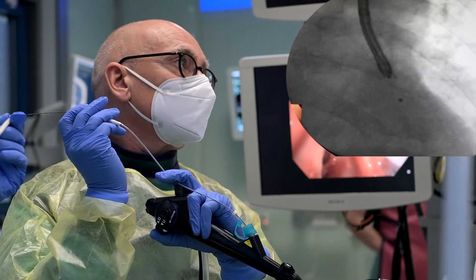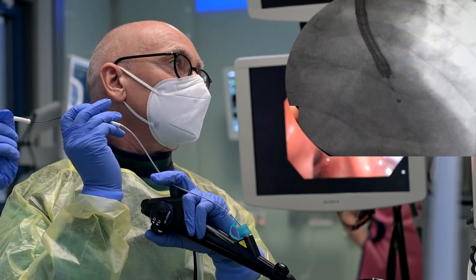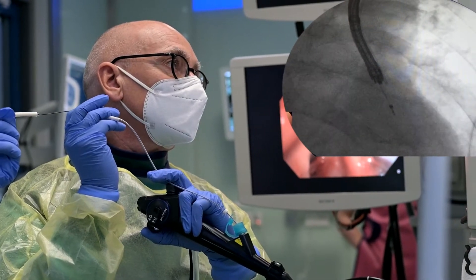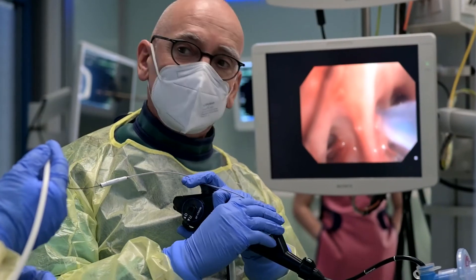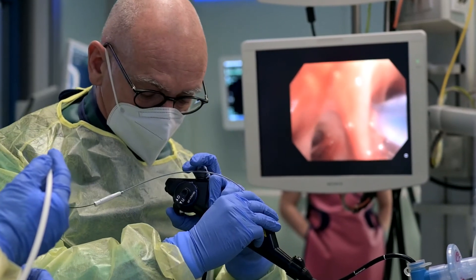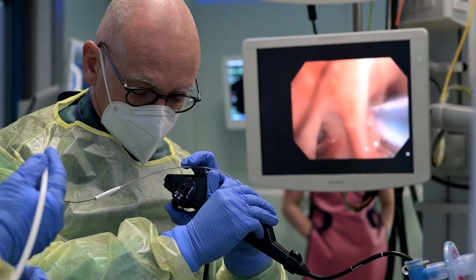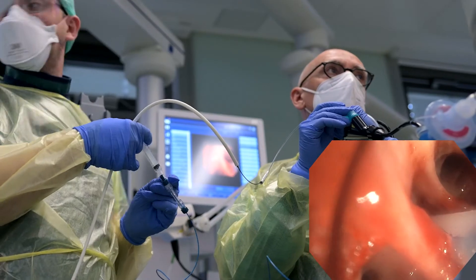Significant guide sheath deflection can be prevented by using the flexible single-use 1.1 mm cryoprobe. Once the cryoprobe is in position, freezing is activated, in this case for 11 seconds. Professor Hart is holding the guide sheath in position with his right hand to make sure that it can be extracted along with the bronchoscope and maintain its position.